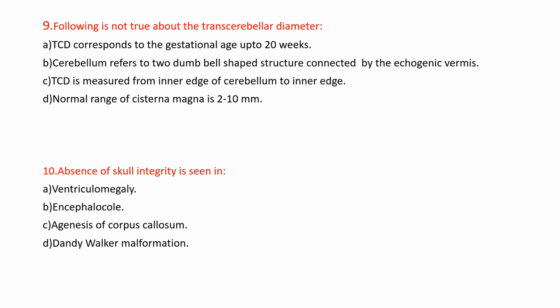So instead of taking that rule, that TCD corresponds to gestational age in millimeters, we would use it only as a rough guide. We should not depend on that, but on centiles. Yes, absolutely. So this is the message. Hope everybody is listening. Next question.